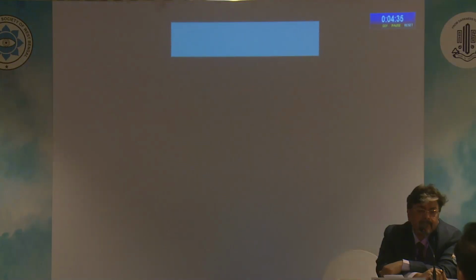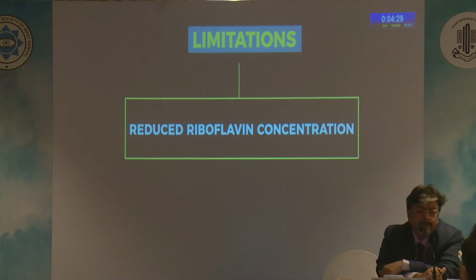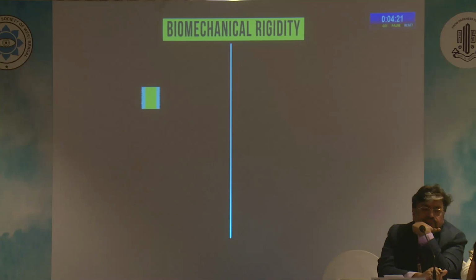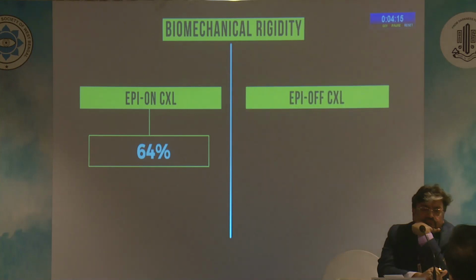penetrance. The second limitation is that apart from impeding oxygen diffusion, the epithelium itself soaks up riboflavin, resulting in its reduced stromal concentration. Wolinsak et al. showed that biomechanical rigidity increased by only 64% after Epi-on CXL, compared to a whopping 320% after the Dresden protocol.